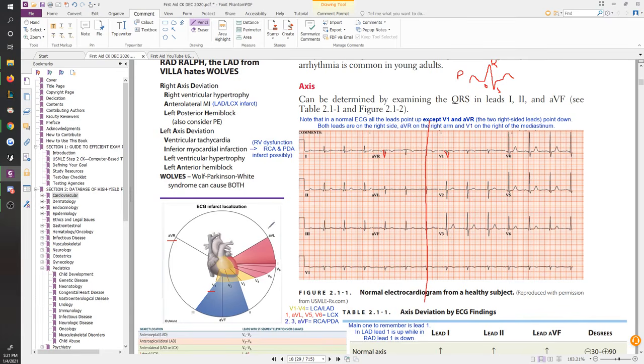And the way the electricity is read depends on the way the heart is actually facing. So since your heart is facing to the left, and since most electrical impulses are going to come from this area right here, where your SA and AV node roughly are, all of those impulses go in this direction. Right? So since those impulses are going in those directions, the line tends to only go up if the impulse is actually going in the same direction as where the leads are. Okay, so since it's an impulse that's going away from AVR and V1, those leads have an ECG complex pointing downwards, right? So it's backwards, and that's the only reason it's pointing down.